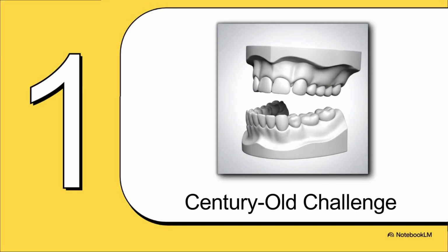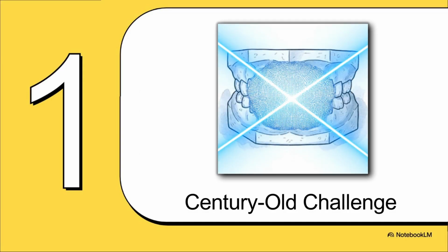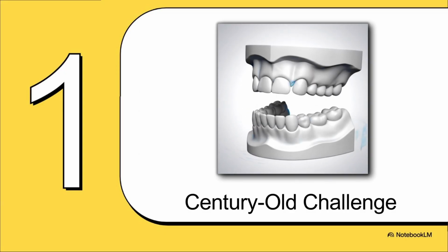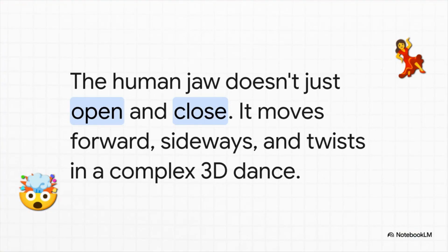For more than 100 years, the field of dentistry has been stuck on this one fundamental problem. How do we actually replicate a patient's unique bite outside of their own mouth? And here's why it's so hard. Your jaw doesn't just swing open and shut like a door hinge. Oh no, it slides forward. It grinds sideways. It even has this subtle twisting motion. It's this incredibly complicated 3D dance, and it's completely different for every person on the planet.